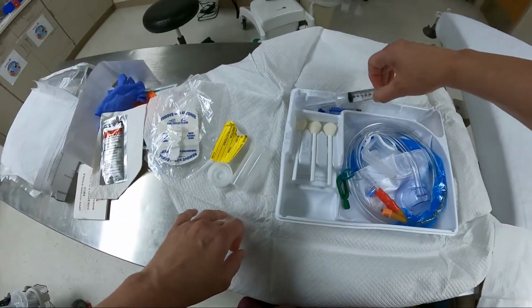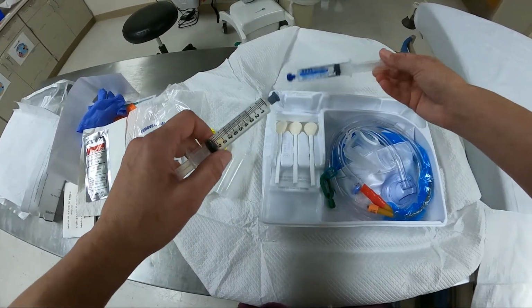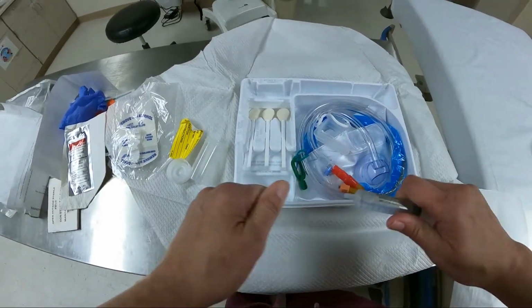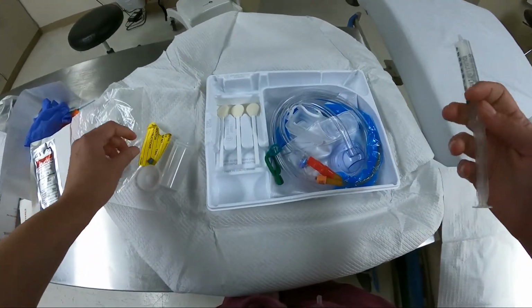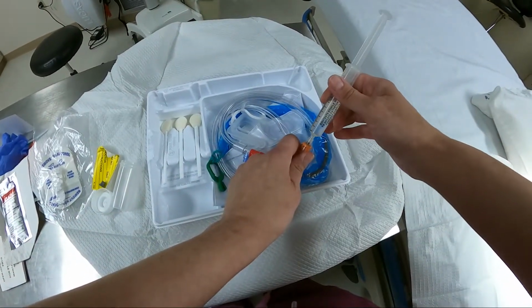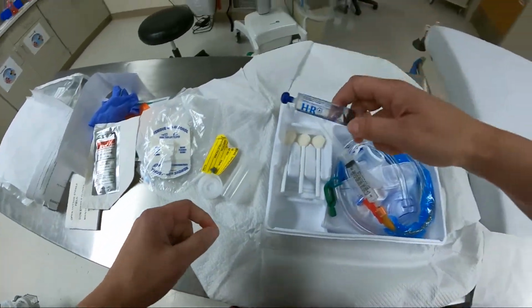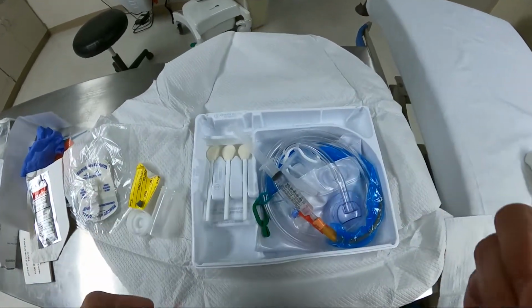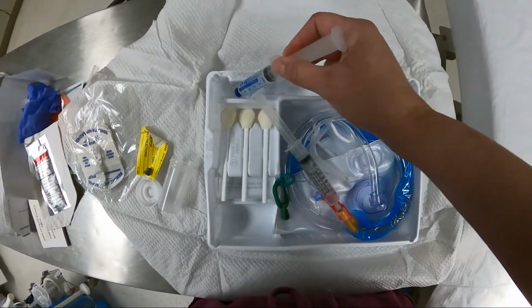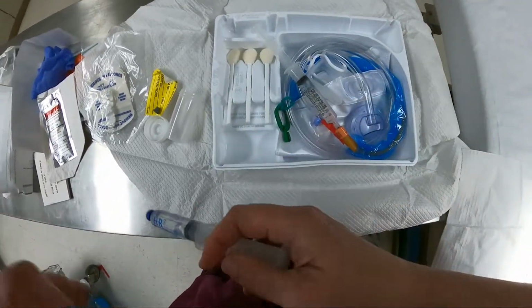Now, it used to be they told you to check your balloon inflation. You don't do that anymore. You go ahead and hook your syringe to your catheter because when you get in there, you want to be able to insert it. Or you can wait, it all depends, because it does make it heavier to control. Then you would put your goo. There's a tray here, and right there is where you put the goo. You just put the goo all along that tray bottom, the whole syringe full of goo.